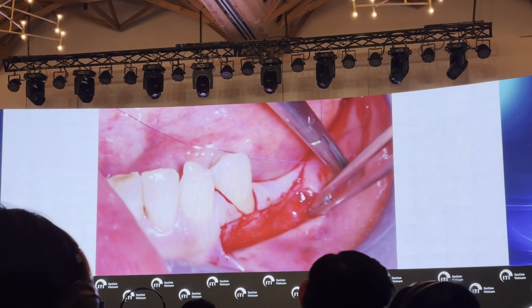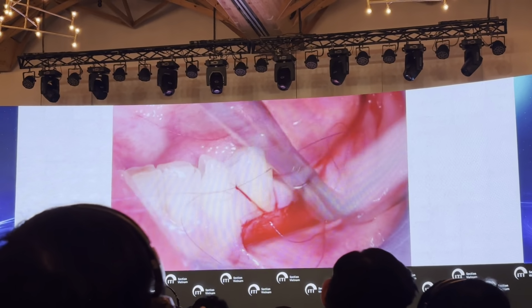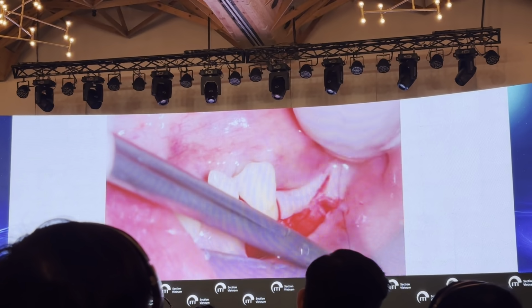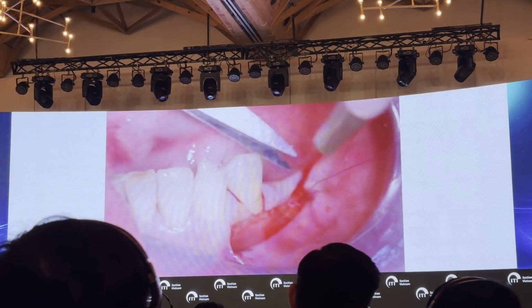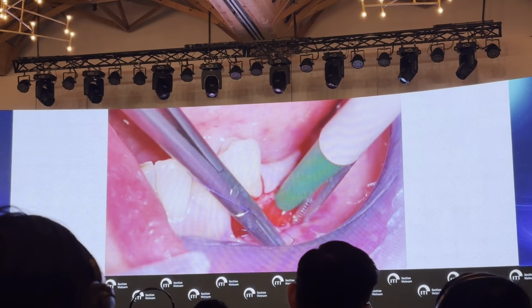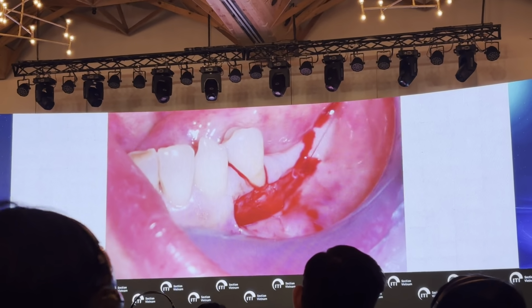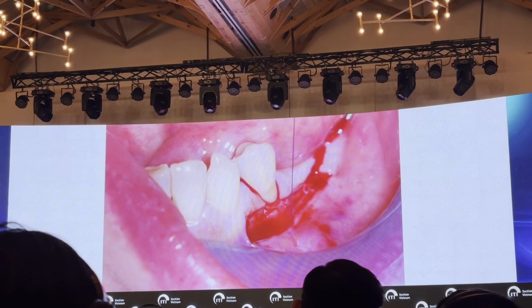So you can take the periosteum and make the alveolar mucosa perforation with the 6-0 suture material, with the 11 millimeter long needle. Be careful to stabilize the alveolar mucosa apically with respect to the ideal position of the free gingival graft. Single interrupted suture, alveolar mucosa and periosteum.